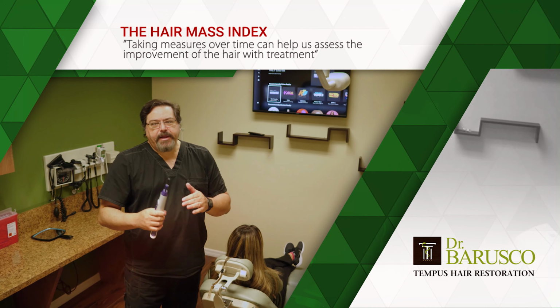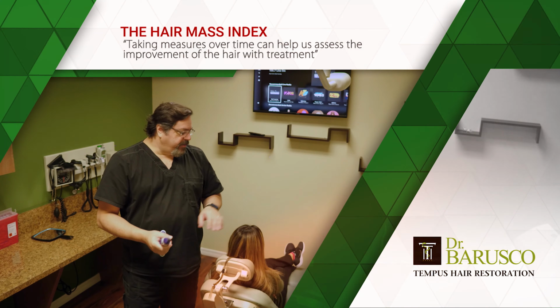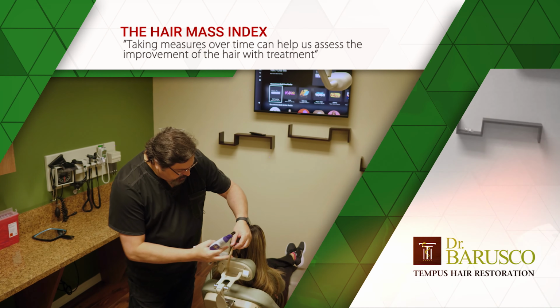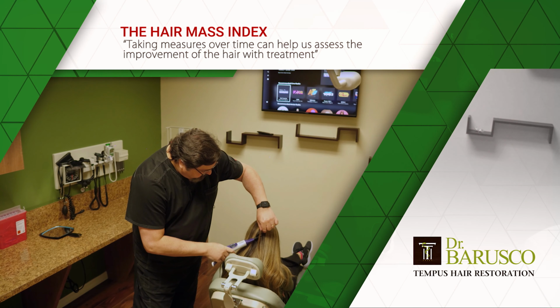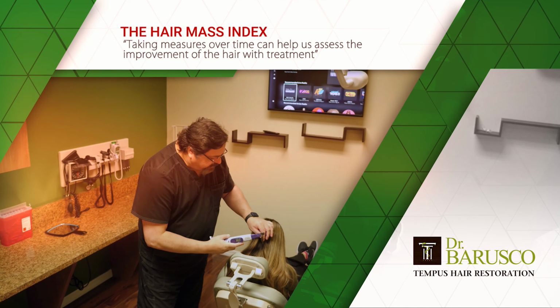So we use that to compare, because then it gives us a measure of her thickest hair compared to the area that's thinning. So let's go ahead and take the measurement here. Have you lean forward. Same process. She's at 140.